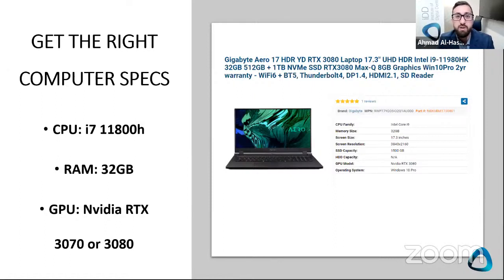It's the single best thing you can do, because bad, slow hardware makes scanning atrociously bad. You will hate it. It lags, it crashes, it's slow. And then you start wondering, what are all these results that people are getting? How are they getting these results? Start with good hardware. That's the best piece of advice.